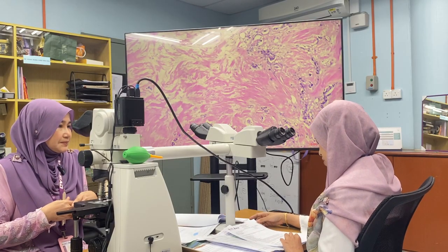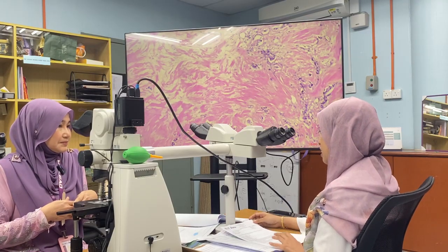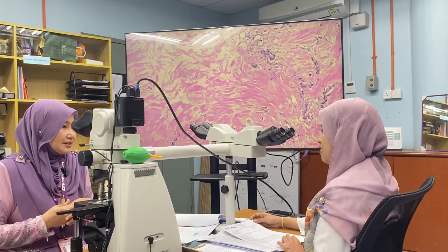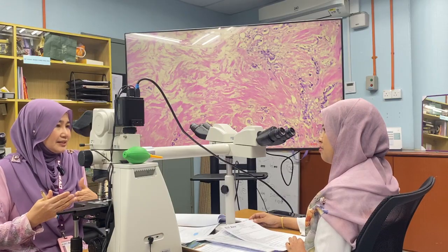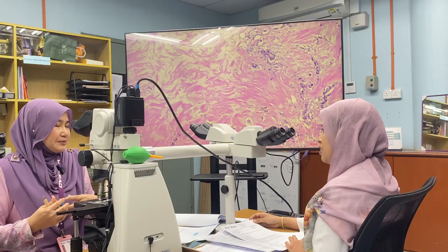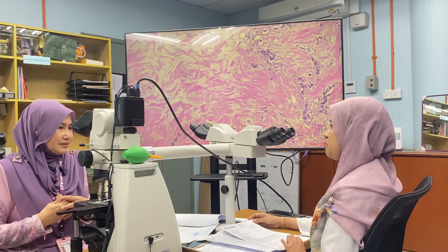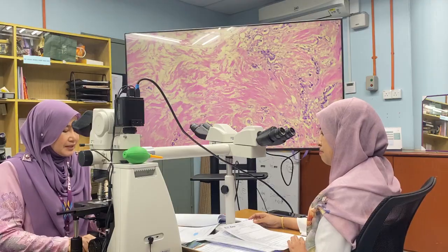No, there's no capsular invasion, but there is a tumor deposit. Tumor deposit, meaning outside of the lymph node. How do we correlate that? Is it from the lymph nodes, or directly from the main tumor? It is usually through hematogenous spread, or direct expansion. All right.